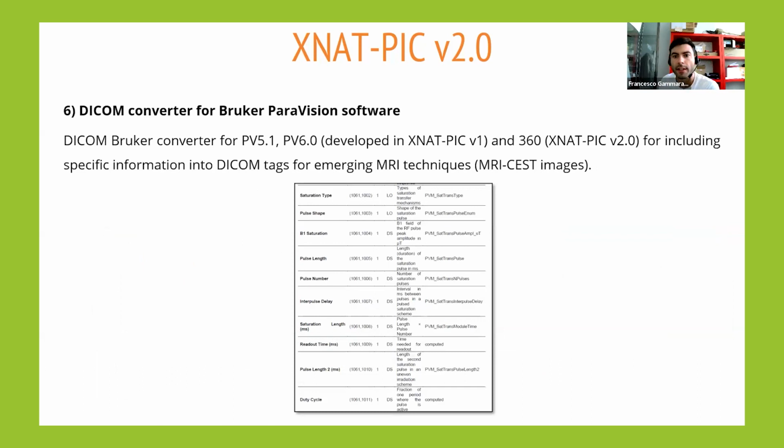And XNAT-PIC version 2 supports the converter for Paravision 360, and we have added some private tags for emerging MRI techniques, and the picture shows you the private tags.